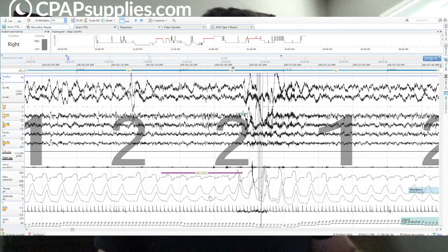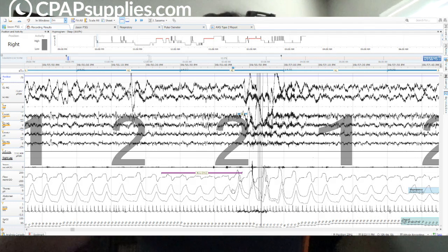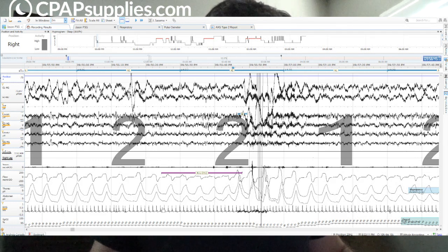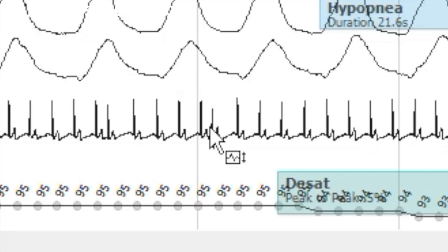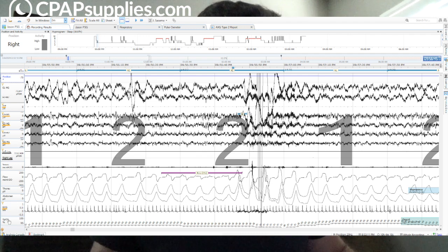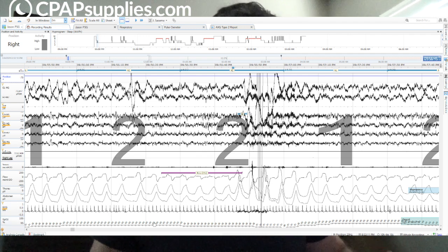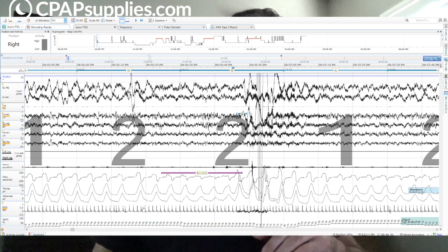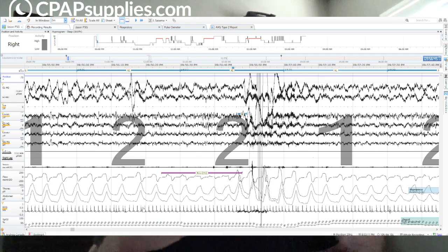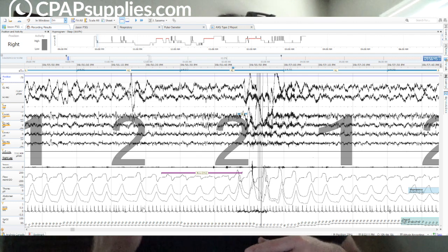We have abdominal and thoracic effort, which is the chest and stomach belt. We have EKG, which we have a lot of PACs going on here, PACs and PVCs. Then we have SpO2, blood oxygen desaturation. All right, this is the important part. I mention these a lot, upper airway resistance syndrome and like AHI sucks, RDI, whatever.